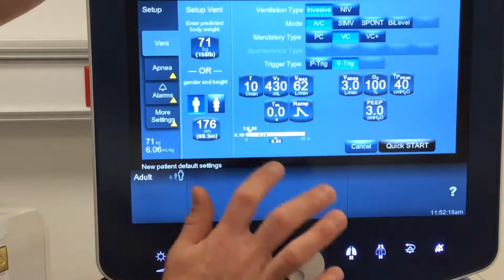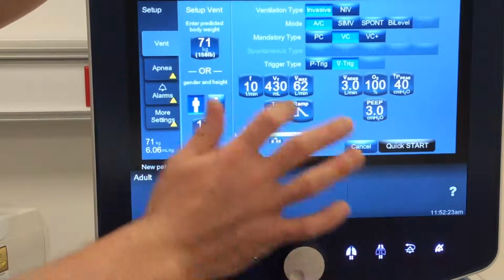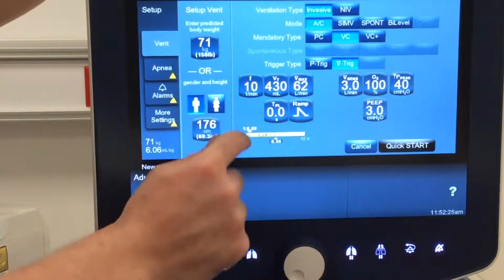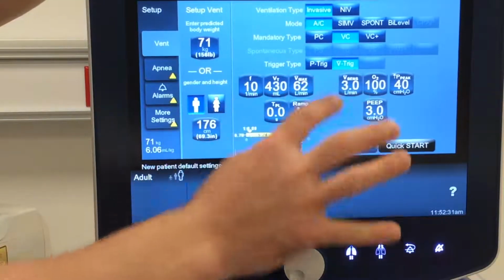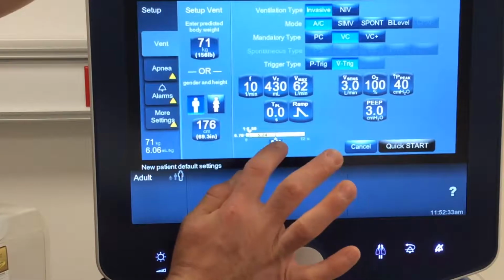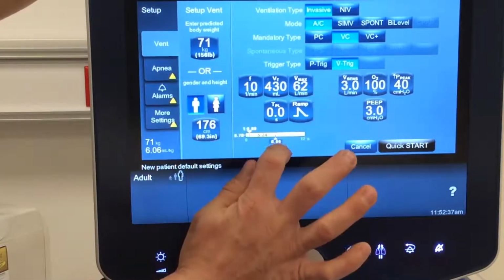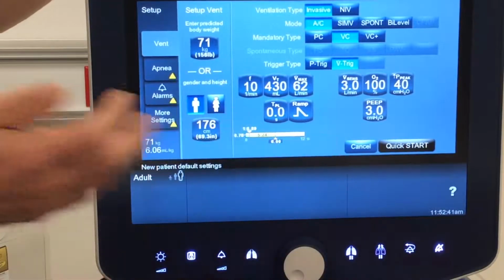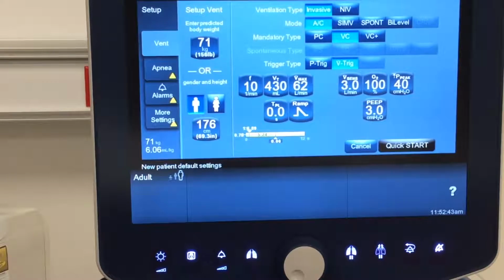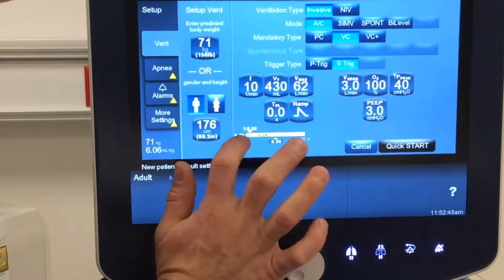And then there becomes whole other aspects of being able to manipulate this as we get a patient that is actively breathing, but that's more for later. Okay, so you can see I have a 0.76 inspiratory time. Based upon all these other settings, if I were to go ahead and start it, it shows me what my cycle time is. So down here, you can see I got a respiratory rate of 10 set. My cycle time is coming in at 6 seconds. So could you do that math in your head? Absolutely. We use that all the time in class. However, it's going to show you that, all right?